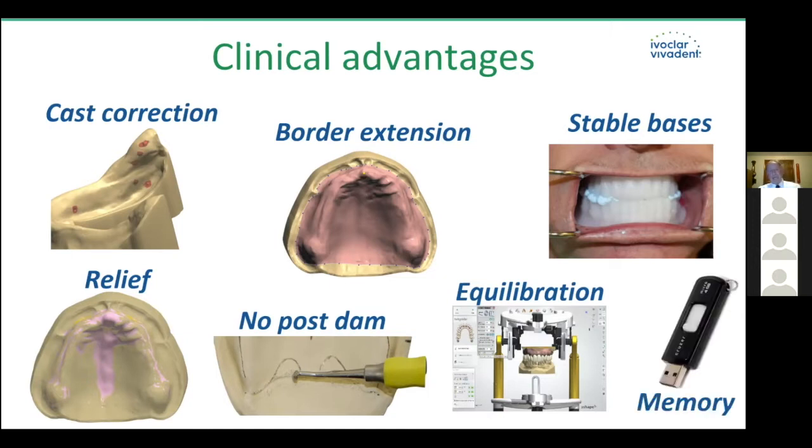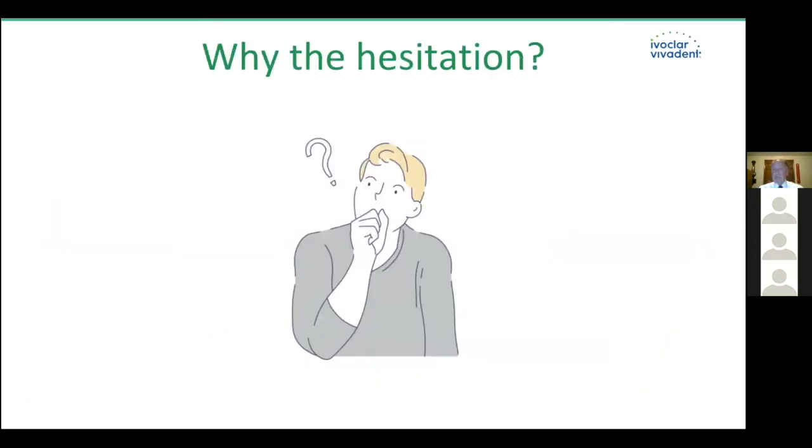Not to belittle this, because this is a huge benefit, and that's having a memory of the setup. Just discuss this with your patient, and you'll see in their eyes how important it is to them that the denture they're wearing is recorded and could be duplicated, exactly duplicated, not just made to look alike. No, exactly duplicated, almost literally at the press of a button, because this is locked into a memory with the software, and that's a great reassurance for the patient. And don't underestimate how important that is to them.